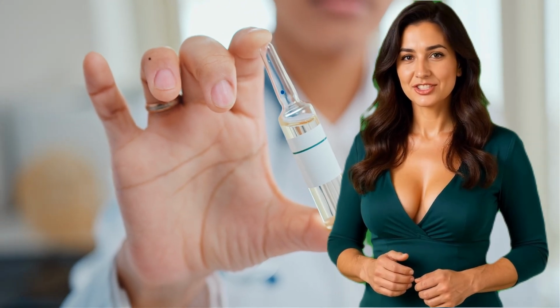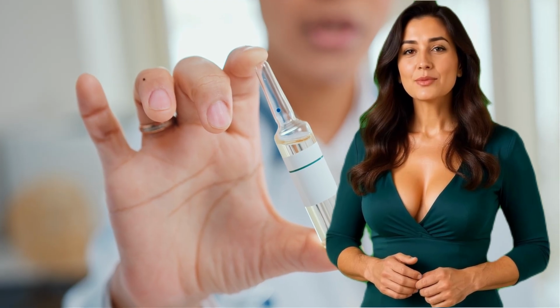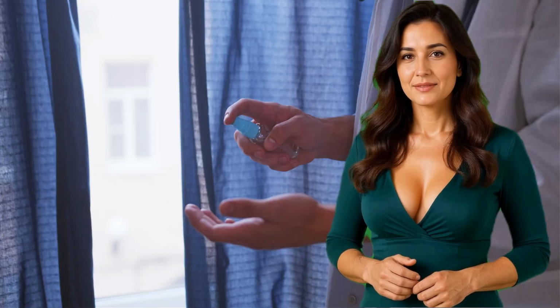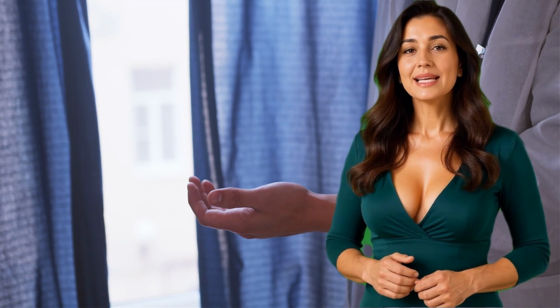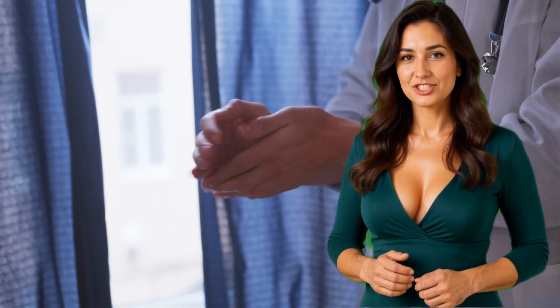Intravenous medication administration is one of the most common procedures performed by nurses. It requires careful attention, proper hygiene, and the correct technique. Safe medication administration is essential for patient safety. In this video, you will learn the basic steps of safe intravenous medication administration.